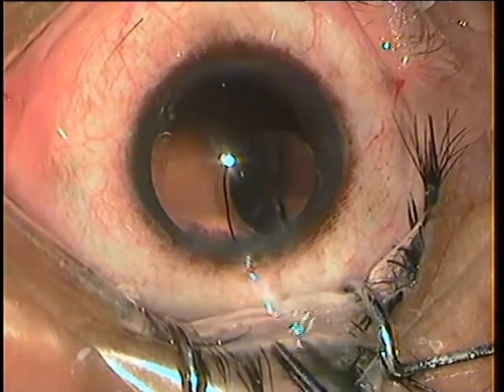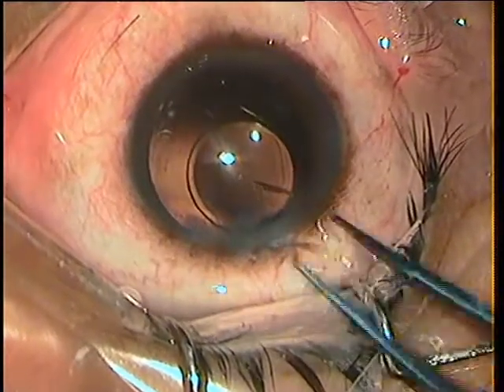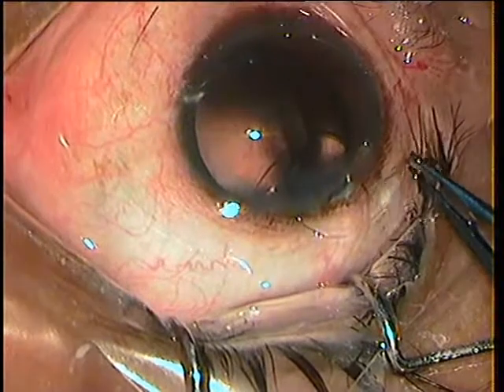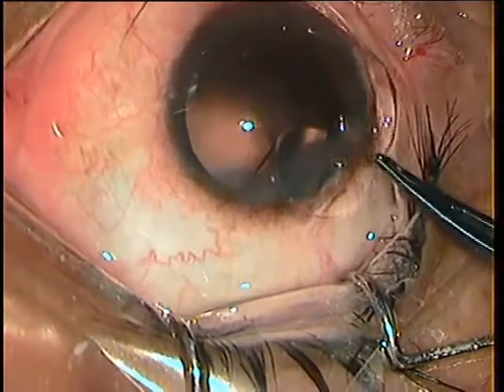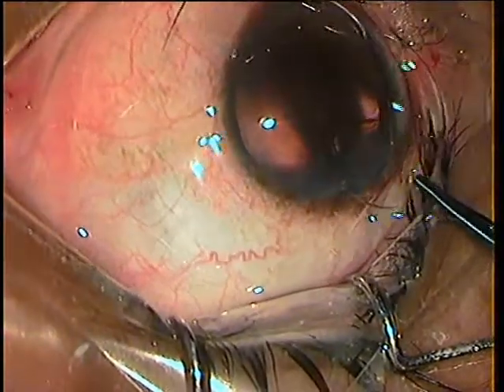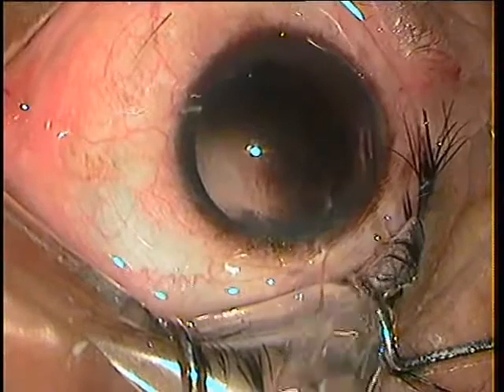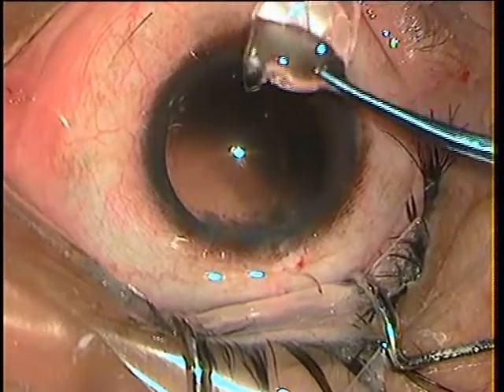With the forceps, I pull out the haptic and engage the cut part of the lens and rotate it. Using the wound as a fulcrum, I rotate it and bring it out. And there is the broken lens.